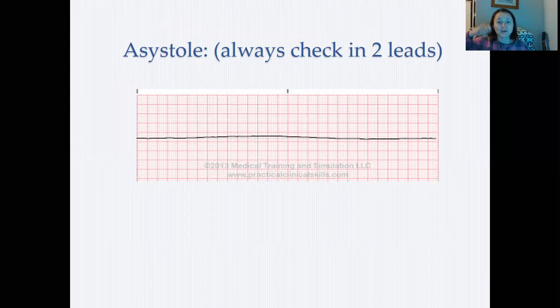It's just like with V-fib. What am I doing? I'm brushing my teeth. Guess what this is doing to this lead right here? I've seen that multiple times. I have run in on people brushing their teeth, where their monitor looks just like V-tach. You run in there, "Are you okay?" "Yeah, are you okay?" So always assess your patient. Treat the patient, not the monitor.